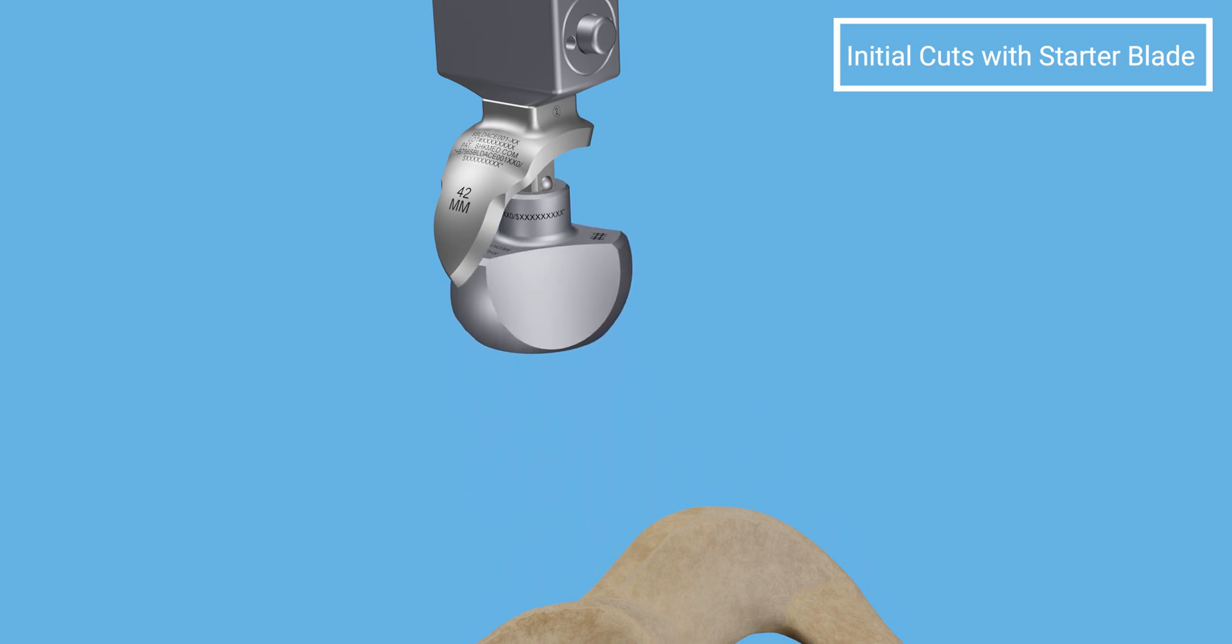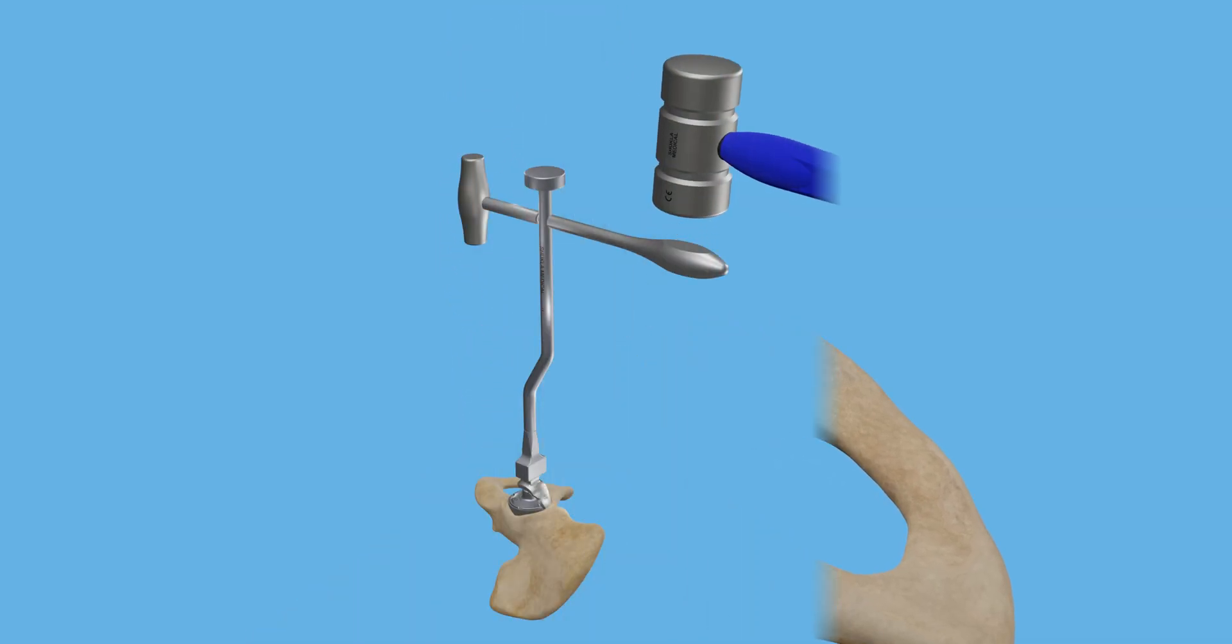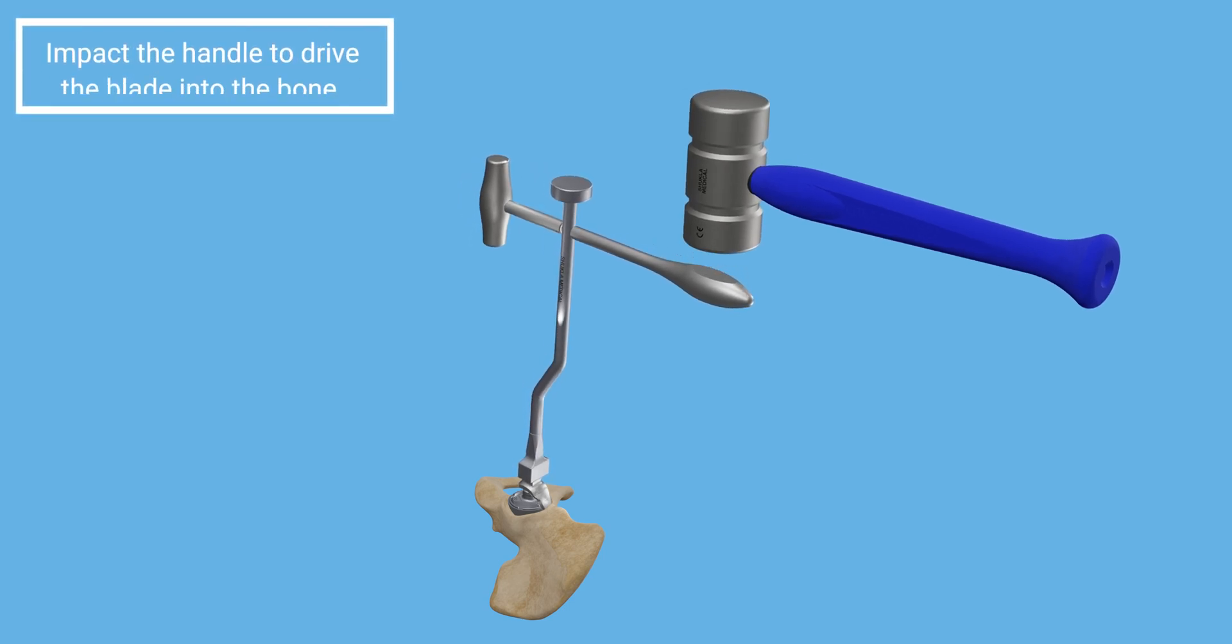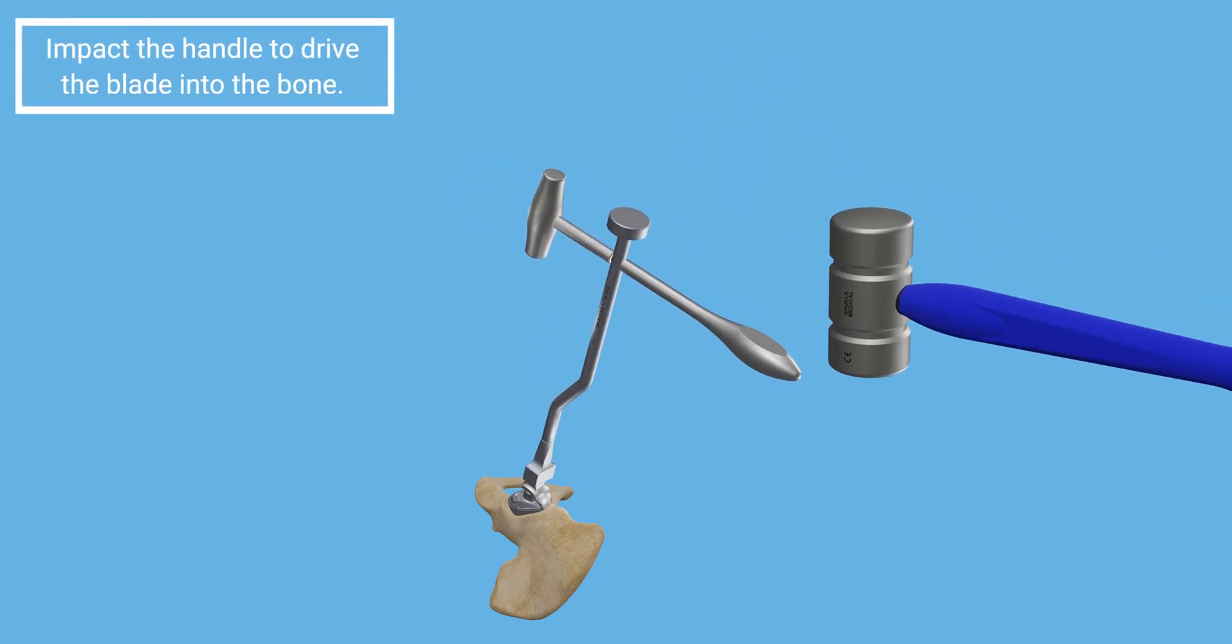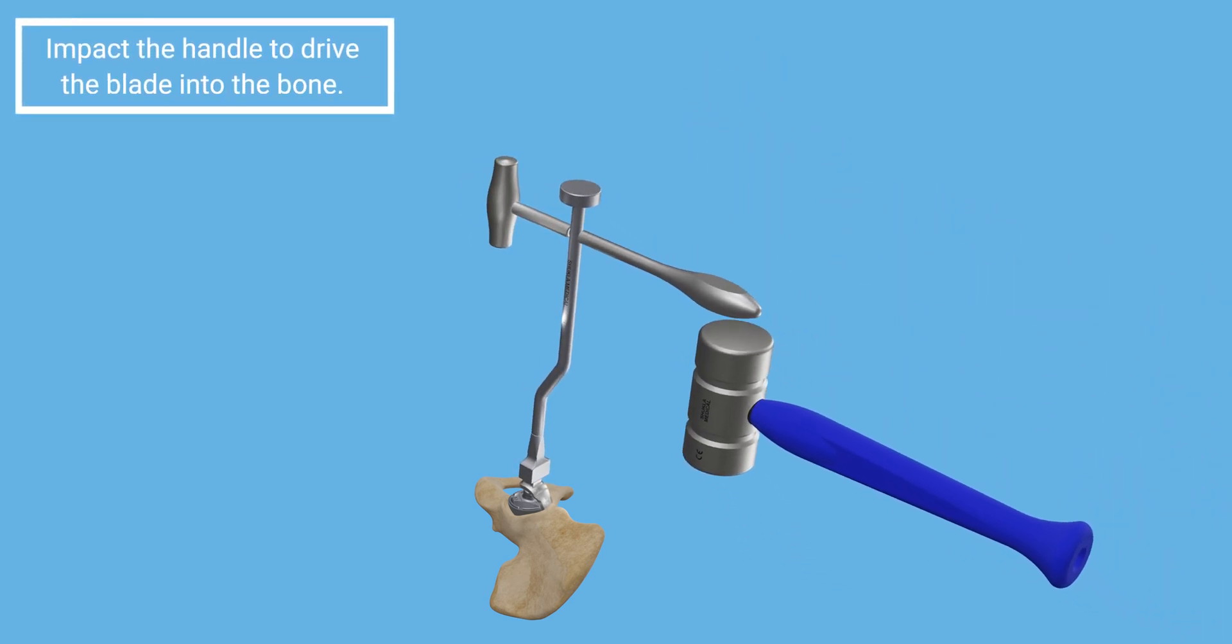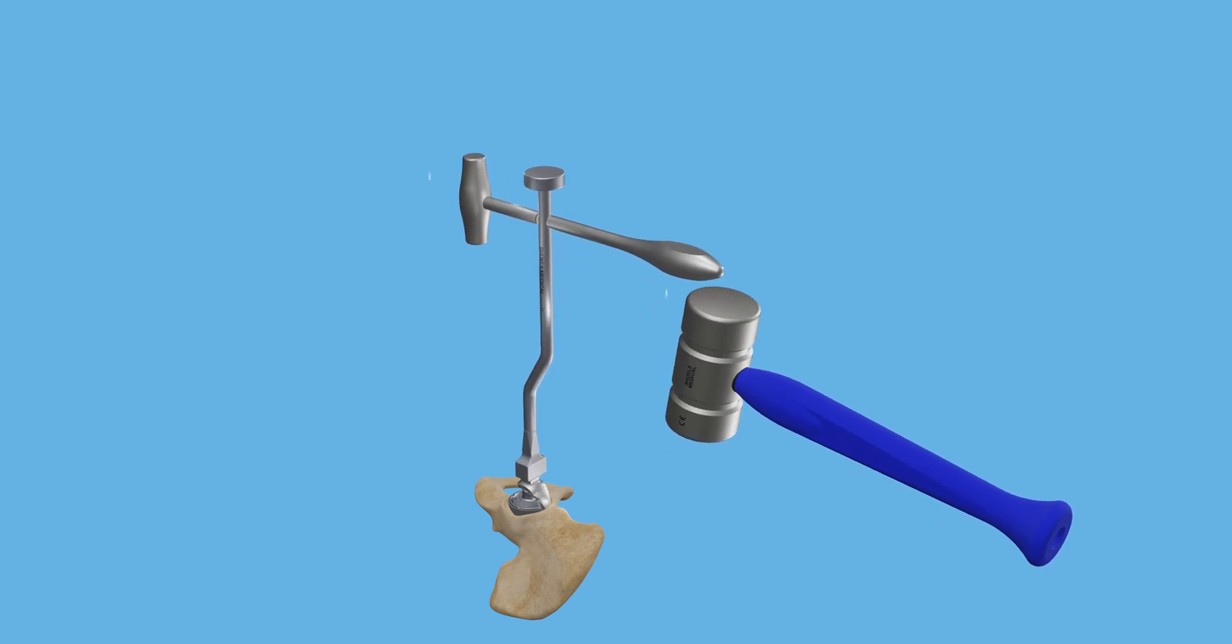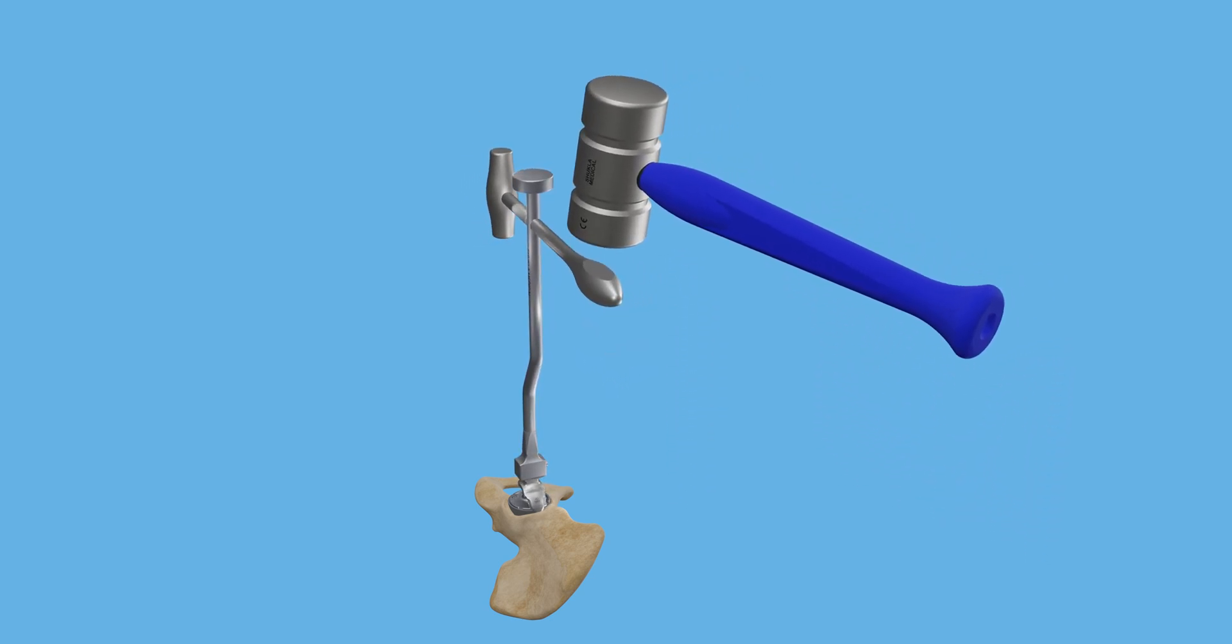Insert assembly into the cup and align the ball or bob by rotating the blade forward and hammering the top to complete a plunge cut. Rotate and repeat for new positions until you've completed a full rotation around the cup.